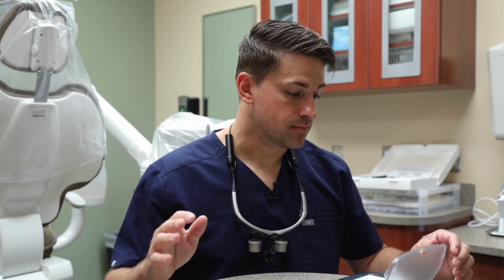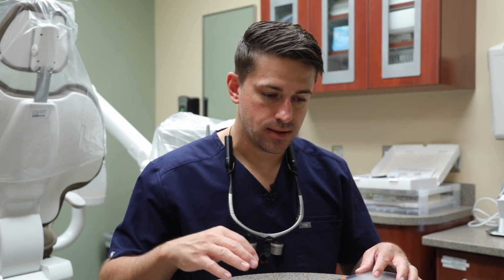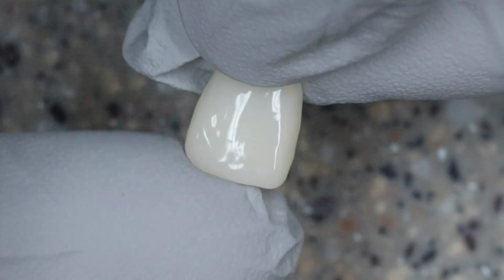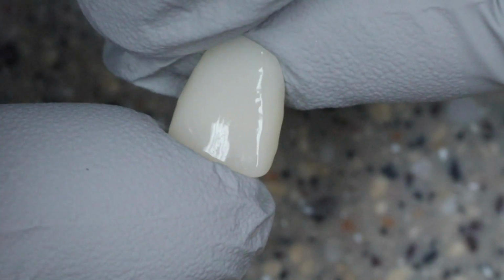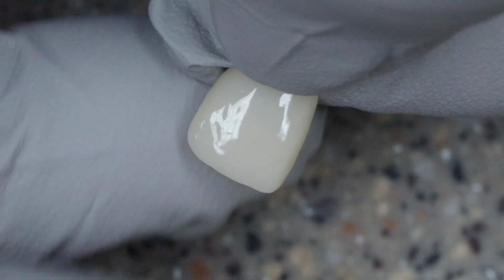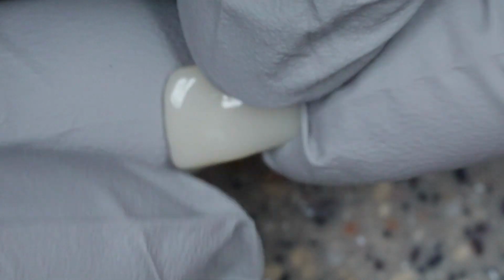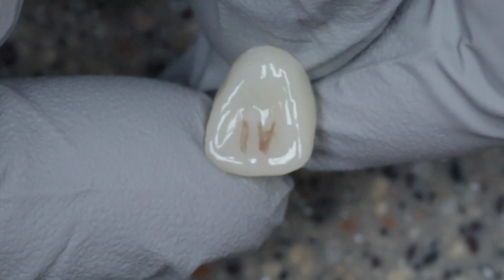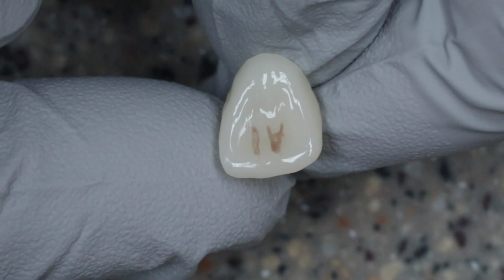So I'm gonna show you what the A1 crown I did recently looks like when it comes out of the glaze firing, so you can get an idea of what this is going to look like afterwards. So let's take a look. All right, so here we have the A1 crown that I did the other day after the glaze firing, and you can see, I mean, that looks pretty, right? The glaze on there, we got the stain on the back that's labeled crown A1.